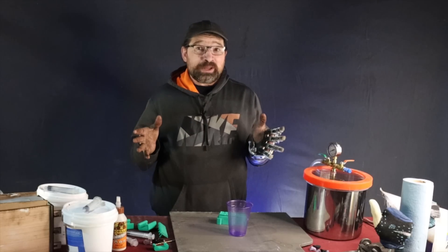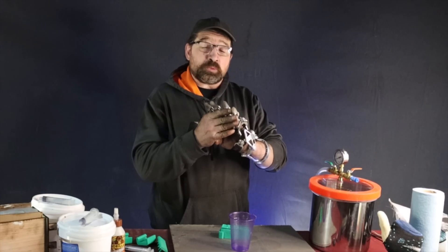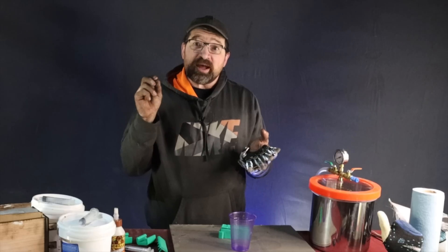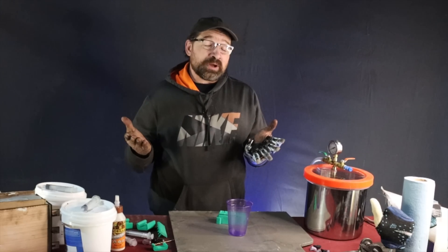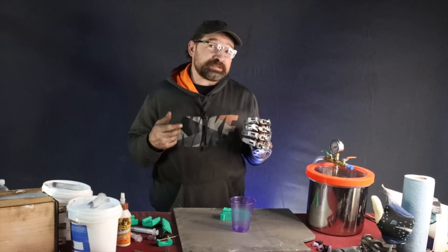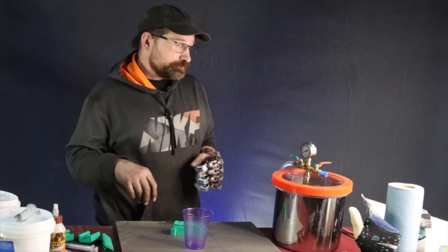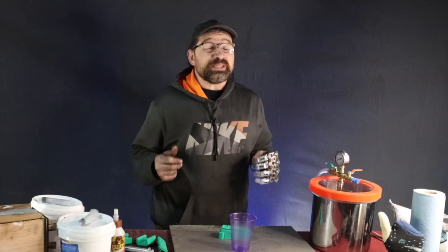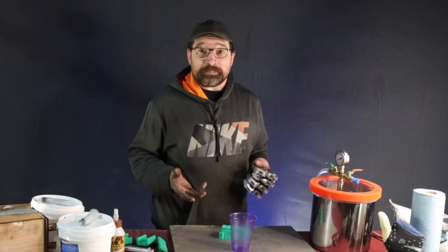Degassing is important but not imperative. These fingertips were done without degassing and they work and look fine — they just have lots of little bubbles in them, which in my case gives me just a little bit softer of a fingertip than if I had solid degassed silicone. It really is amazing how much air is trapped in the silicone.